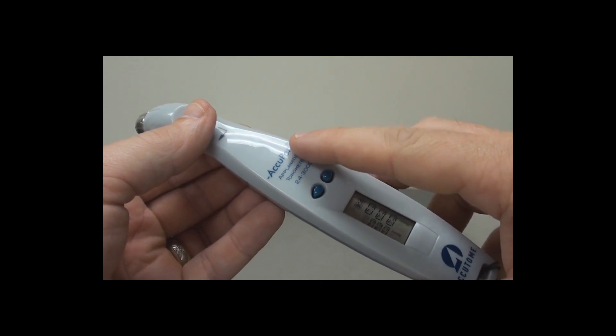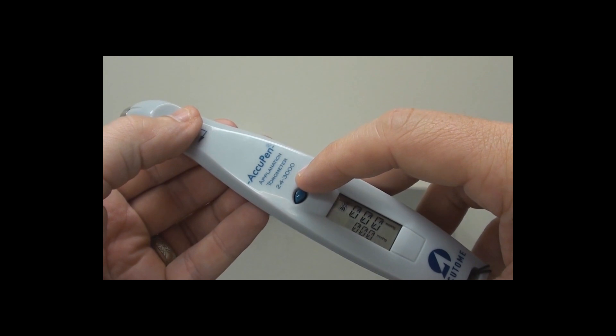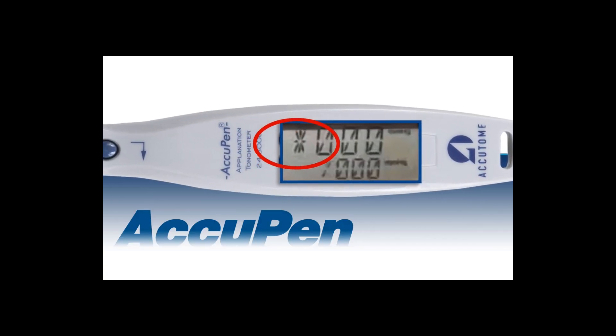To view the acquired measurements, use the arrow keys. When multiple measurements have been captured, an asterisk next to one of the numbers will indicate the furthest from the average.